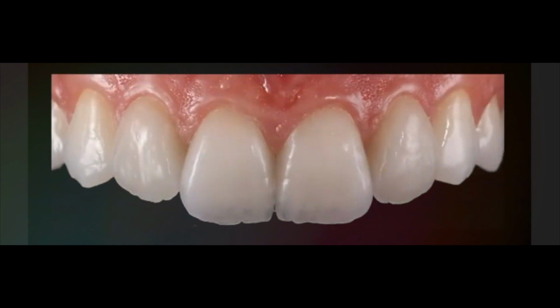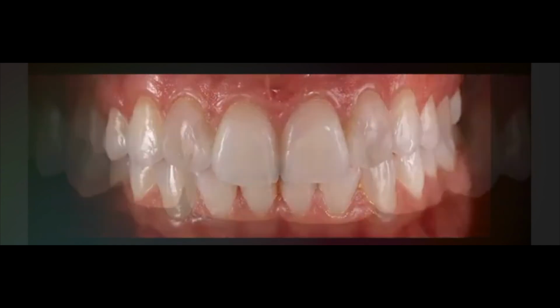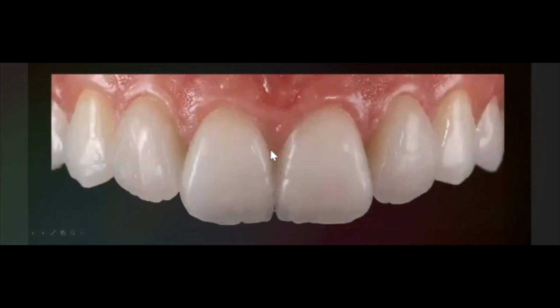This is 2 months after cementation. But for me, what is impressive in this case is this. Look how it was before, the black triangles, and how it looks now without any black triangles, nothing. We didn't do any surgery, nothing perio. The only thing, we changed the orientation and the position of the contact surface, and also we created a new emergence profile in order to push the papillas, to create a lateral push of the papillas, and to apply a bra effect on the papillas, so we get higher papillas.